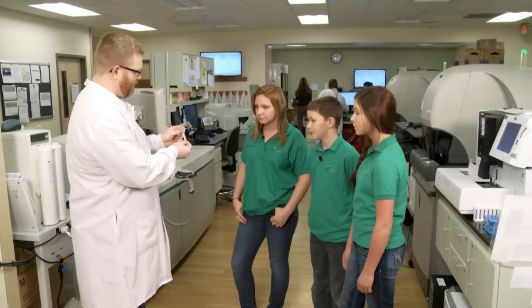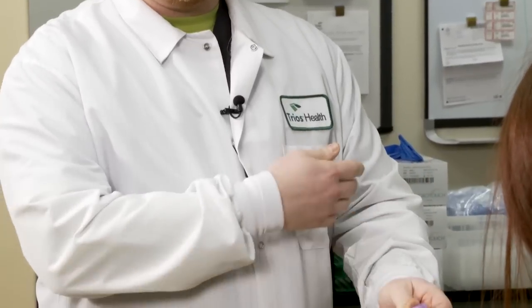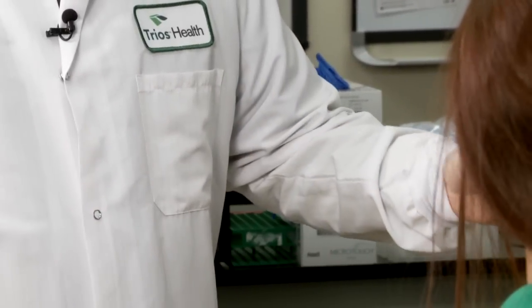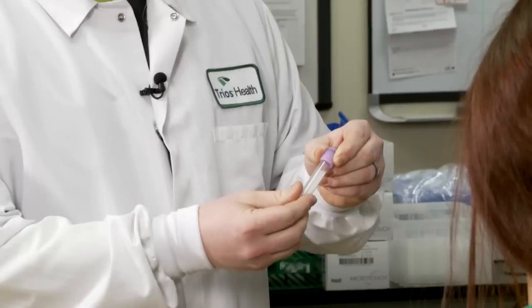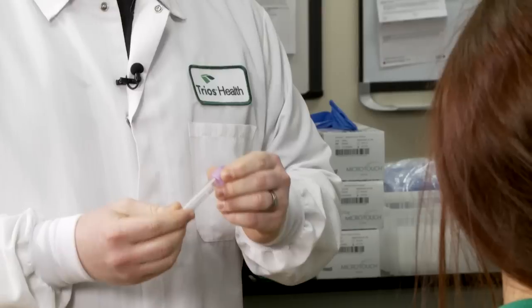This one has a purple top. In this tube the blood will stay just like it is when it comes out of your body — it'll stay red and it'll look the same. And we use this tube to do cell counts.